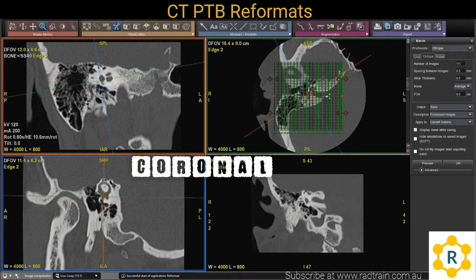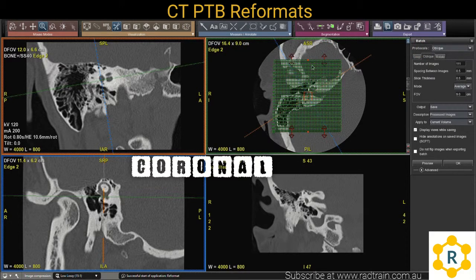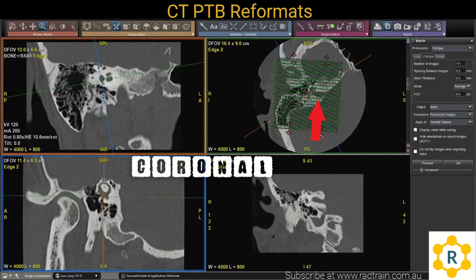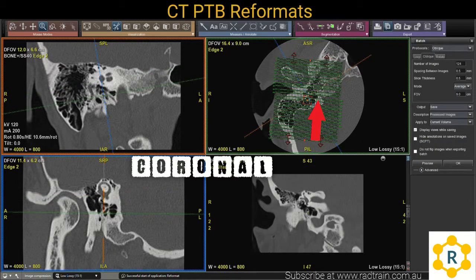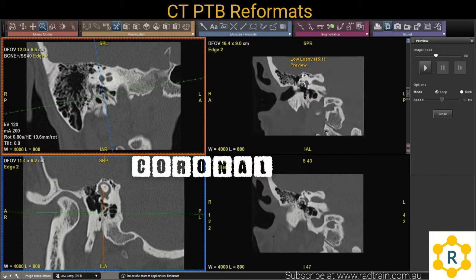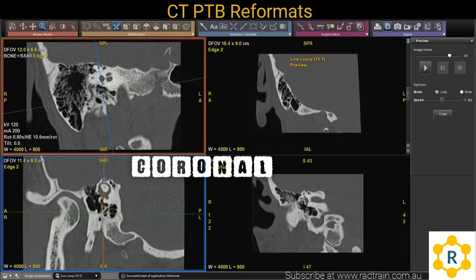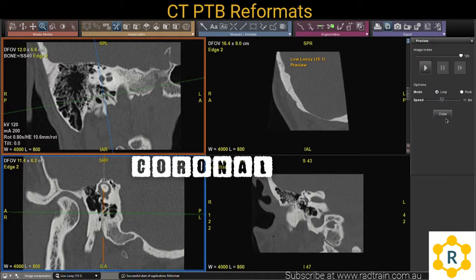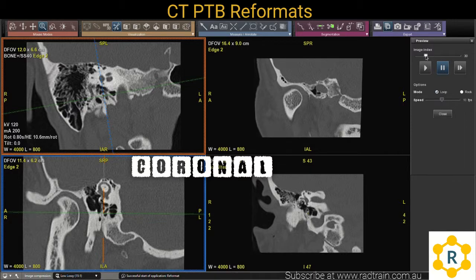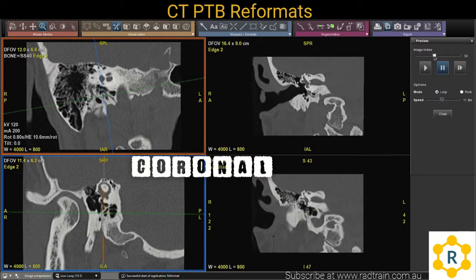The coronal plane is usually 90 degrees to the axial, but I usually angle to the IAM, which you can see on the axial plane there, and again try to get all the mastoid air cells on. This should give you a good view of all the semicircular canals and the cochlea as well.